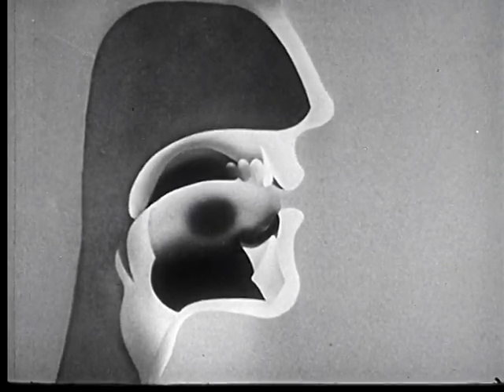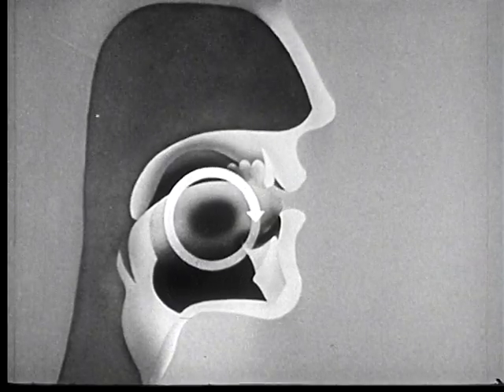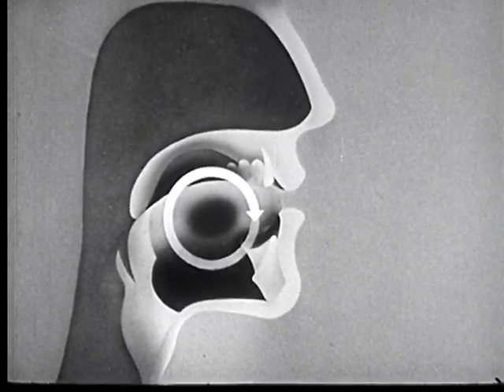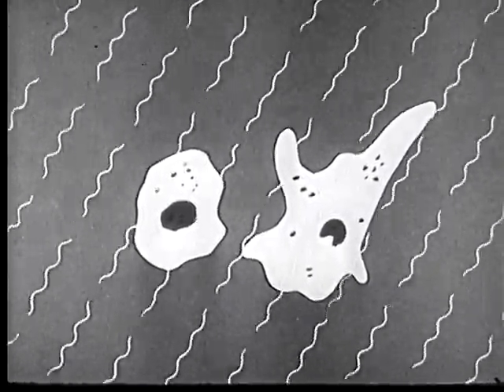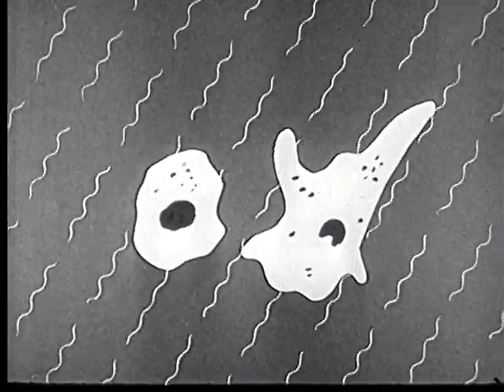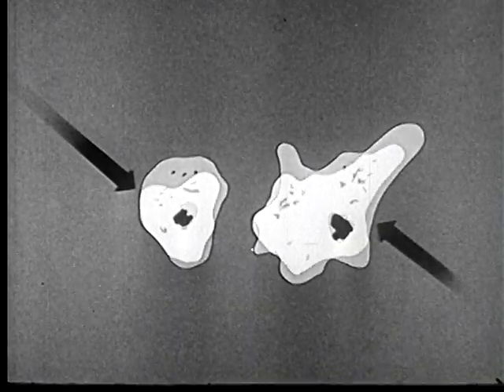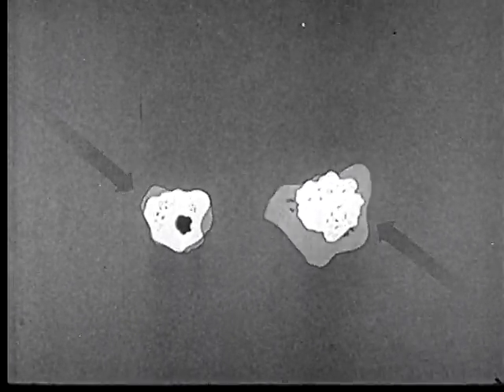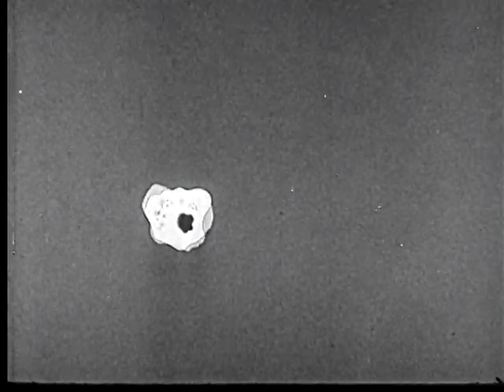Because Mrs. Gordon's tongue has a growth of malignant tissue, high-voltage X-rays are being prescribed to achieve the desired therapeutic effect. These high-dosage X-rays have a lethal effect upon cells which gradually destroys them. However, normal cells are not killed as rapidly as the malignant cancer cells. X-rays, therefore, can be used to destroy cancer cells without permanently damaging surrounding normal cells, which can recover from the effects of the radiation.